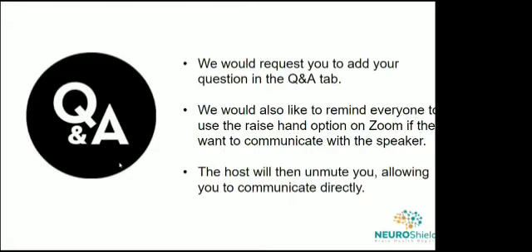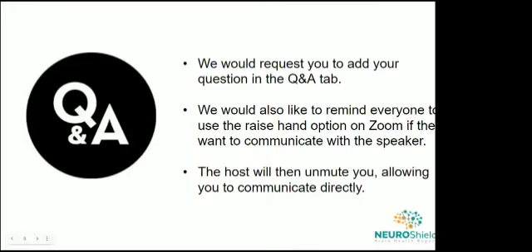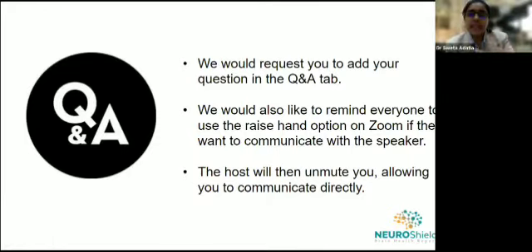Could you please repeat on the implications of collaterals on therapy? Yes, thank you for that question. I showed a very nice slide where, if there is a potential presence of collaterals on a multi-phase CTA, the outcome is going to be far, far better than without the collaterals, which means the tissue gets enough perfusion. So the reperfusion, whatever you're doing, thrombolysis or a clot retriever, the chances that the outcome for this patient is going to be quite robust. This has been shown in the trial, in fact it was one of the trials which the Calgary team had launched way back, but this has still remained quite robust.